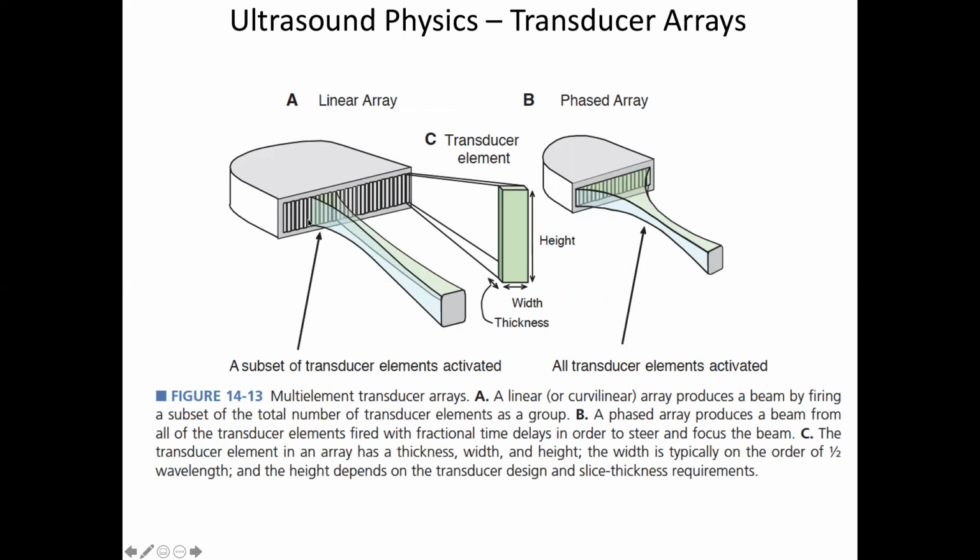And we'll stick a whole linear array of these crystals along the face of the transducer. In the most simplistic way of rastering to get a two-dimensional image, we'll just temporally raster across this crystal, and we'll make a 2D picture just by changing the position of the focal point.